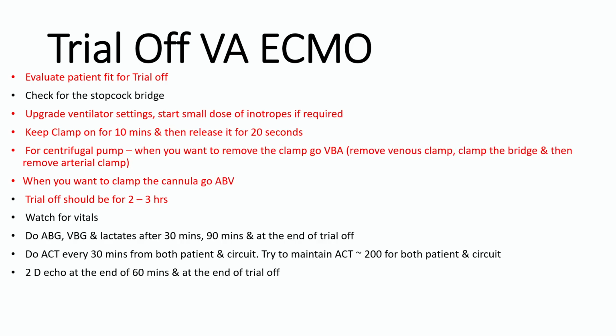Then the important factor is to assess the heart. For that you need echocardiographic parameters also. In echocardiography, you are looking at whether there are any issues with the ejection fraction, how much the ejection fraction is, whether there is any MR, and whether there is chamber dilatation. You would always want no MR or only mild MR, an ejection fraction of more than 30%, and an LV that is not getting dilated.